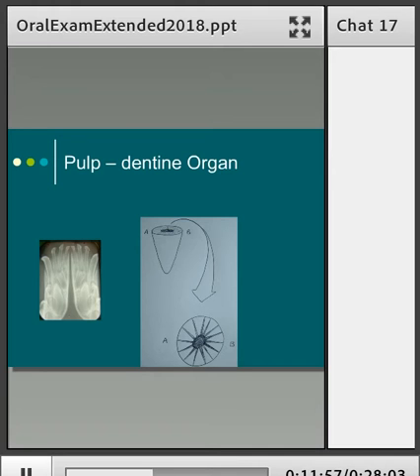And here we can see we're maturing now, and we've got the deciduous tooth with the thicker dentine. However, our immature permanent tooth here, this canine, you can see that the walls are extremely thin, and they just kind of stop. That one stopped there, and again here come to an abrupt halt, and all of this is our pulp, and it just seems to continue into the bone there. And of course that's because this is a young animal, so we're looking here probably about 5 months of age, something like that.